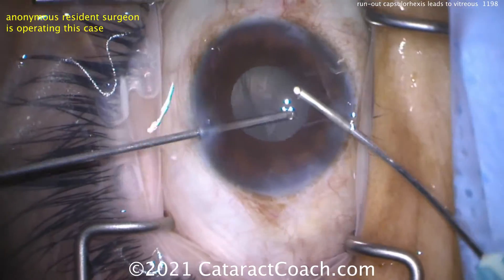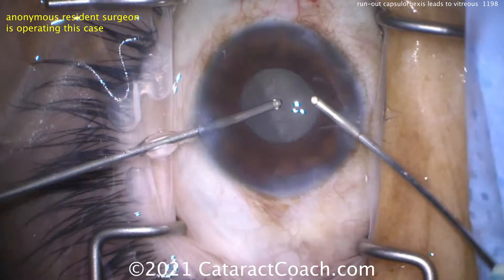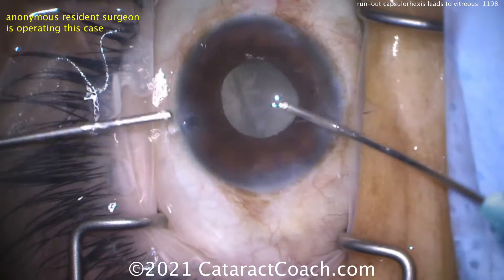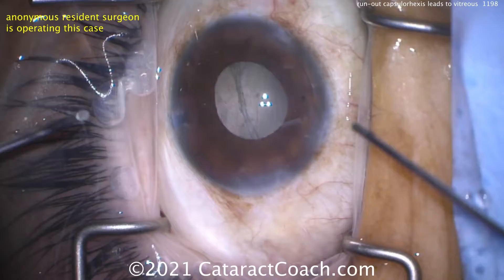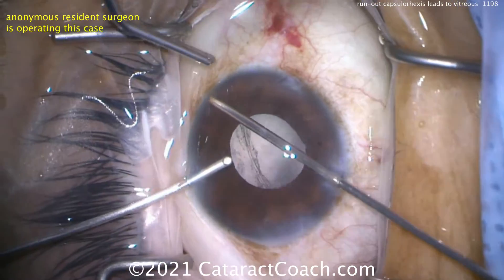Removing the vitreous and restaining it — it looks pretty good. Let's do a complete clean-out. A little bit of a white reflex is because you have triamcinolone particles in the vitreous — that will help. Checking again, and I think we've cleared all the vitreous from the anterior segment. Now we can safely implant a sulcus IOL. You can see the rip in the central cap — that shows exactly what happened.